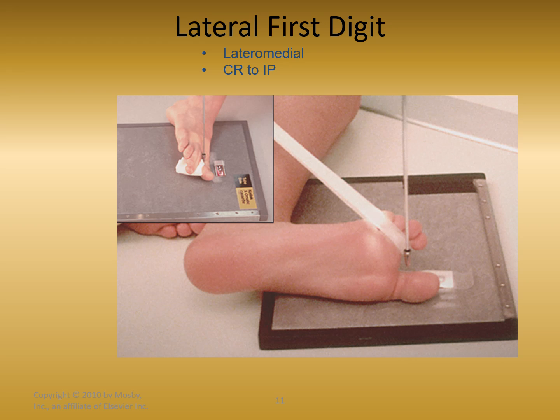For our lateral toes, we're back to that thought process of, is this a medial lateral or a lateral medial projection? In the case of digits 1, 2, and 3, we will medially rotate the foot and use a lateral medial projection of the beam for digits 1, 2, and 3. That's to place them as close to the IR as we can get them, and to avoid OID as much as possible so that we can get the best detail on our image.